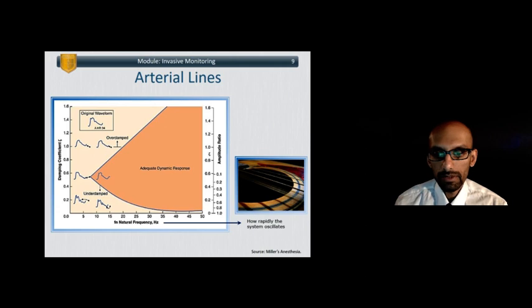So even though we're made up of a lot of different things, the one thing that human beings do that creates a fundamental frequency is our heartbeat, and it generally beats along the same clip until you become tachycardic or bradycardic, of course. But for a certain stretch of time, your heart rate remains unchanged, and let's say hypothetically your heart rate is 60, that's 60 beats per minute.